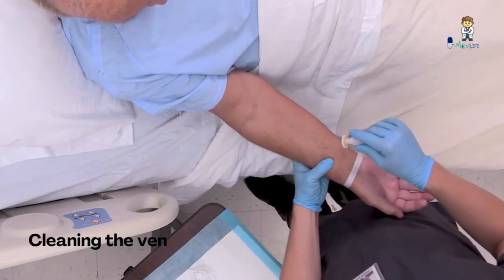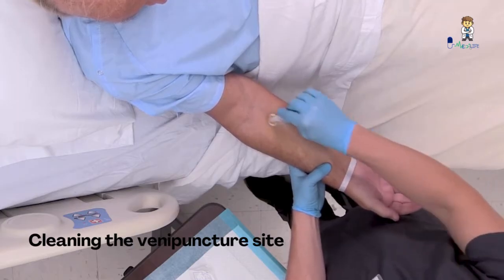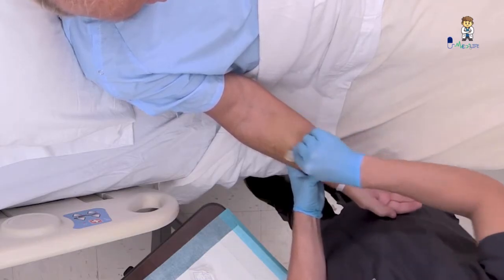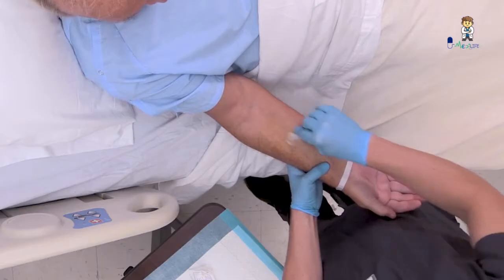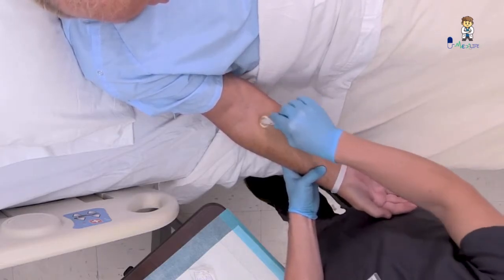Clean the venipuncture site with an antiseptic pad following the manufacturer's instructions. If using chlorhexidine, apply using a back-and-forth scrubbing motion for at least 30 seconds and allow it to dry completely. Don't palpate the site again to avoid transfer of microorganisms to the venipuncture site.